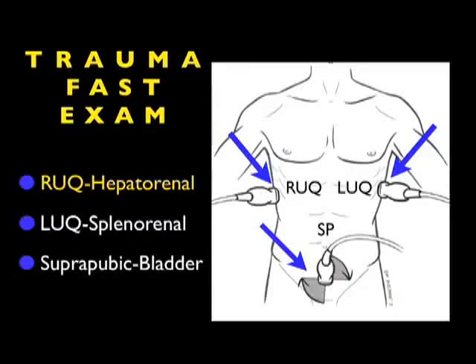So in conclusion, I'm glad I could share with you part 1 of the right upper quadrant view of the trauma FAST exam. Now we know how to recognize a normal examination, looking all the way from the area below the diaphragm through Morison's pouch and terminating at a view of the caudal tip of the liver. So I hope to see you back as SoundBites continues and we look at part 2 of the right upper quadrant view, focusing on positive examinations.